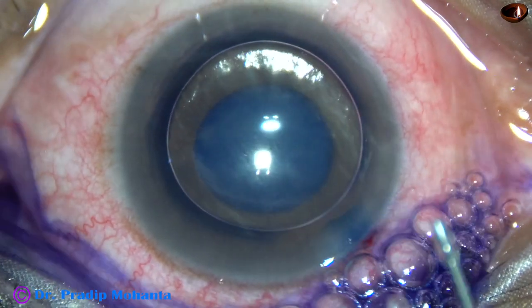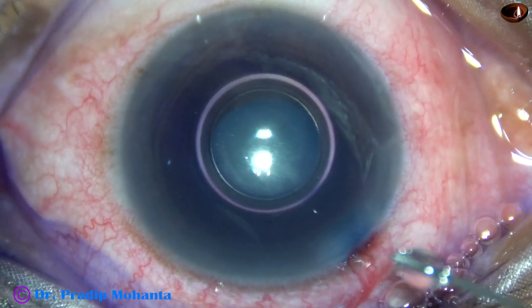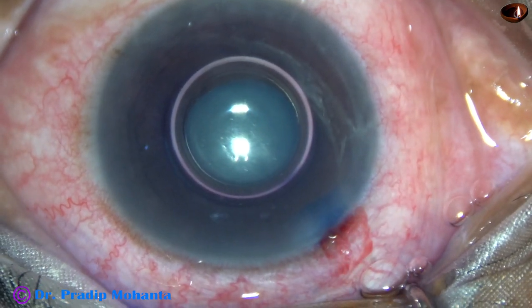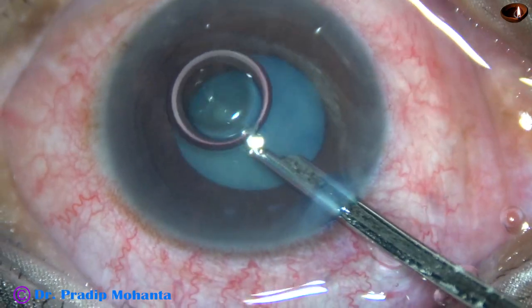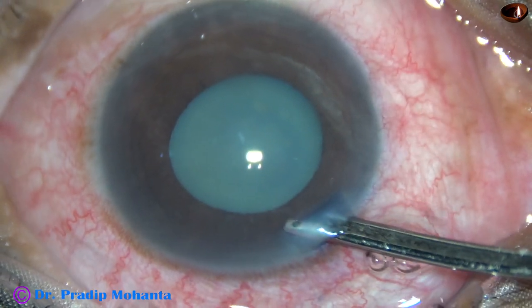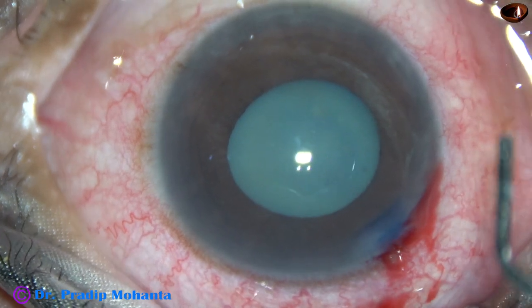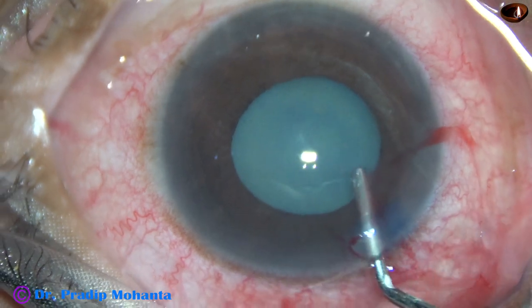This is a bit of adrenalin. This may help in maintaining the dilatation of the pupil, and it may cause some more dilatation. But in this case, it has not dilated the pupil to a significant extent — still a little bit of dilatation has occurred due to the adrenalin.